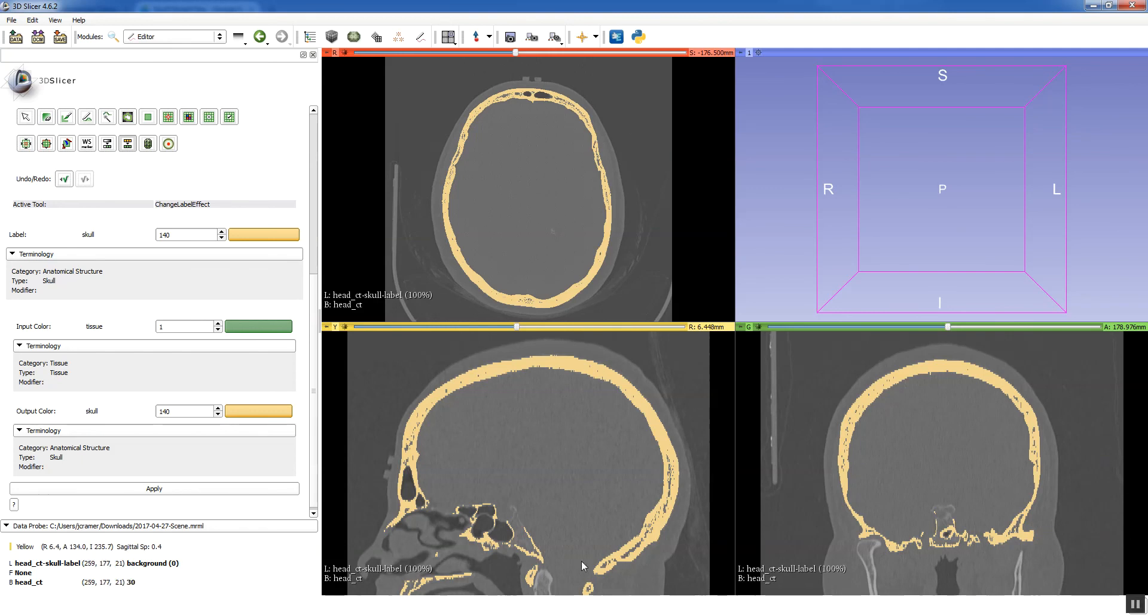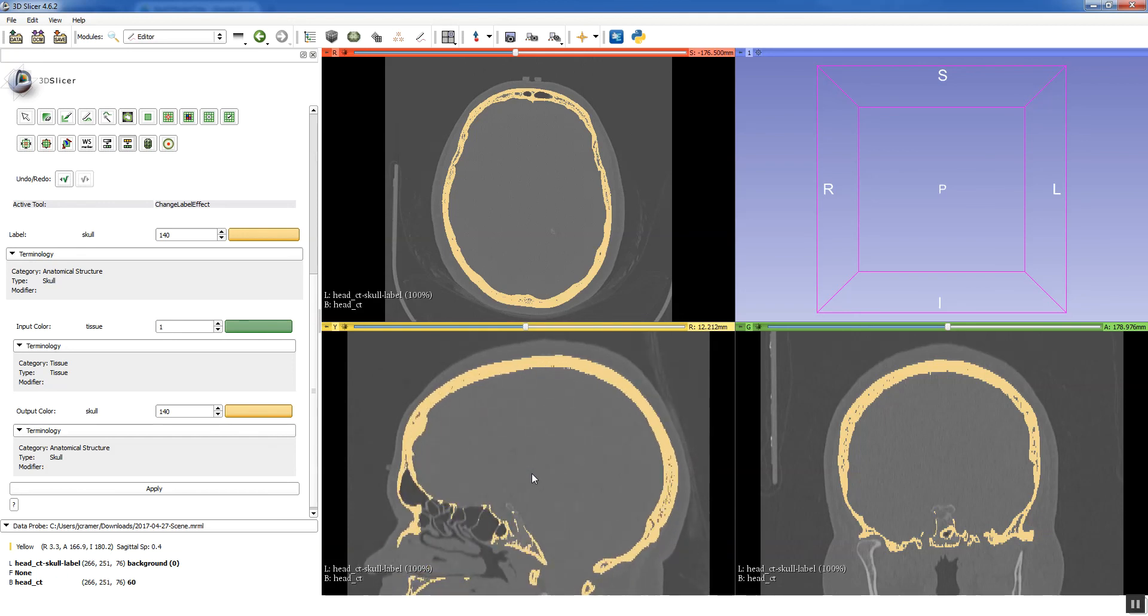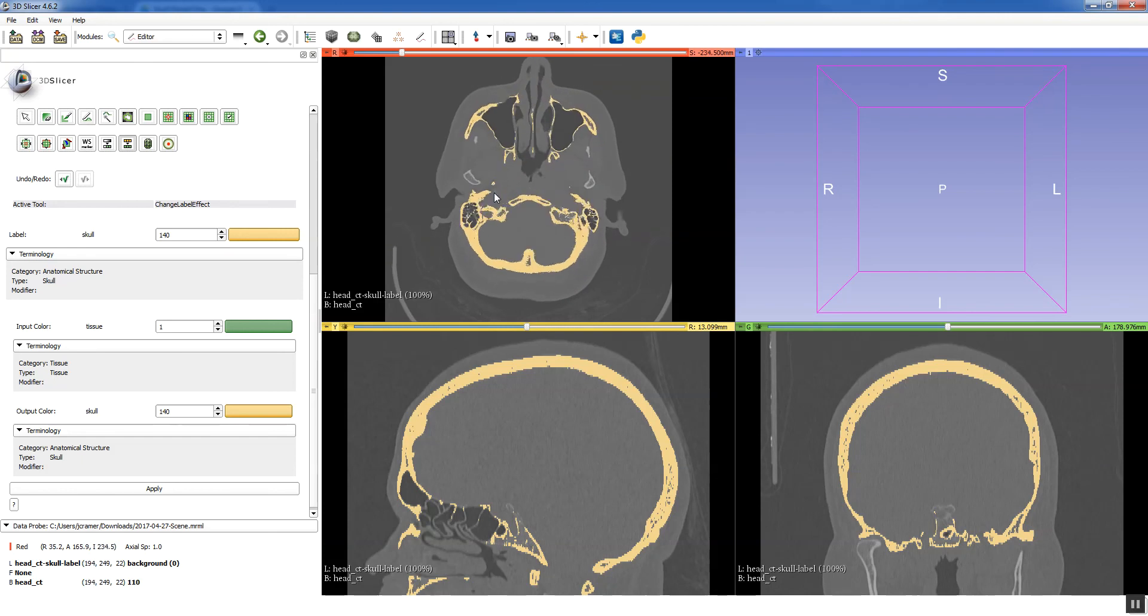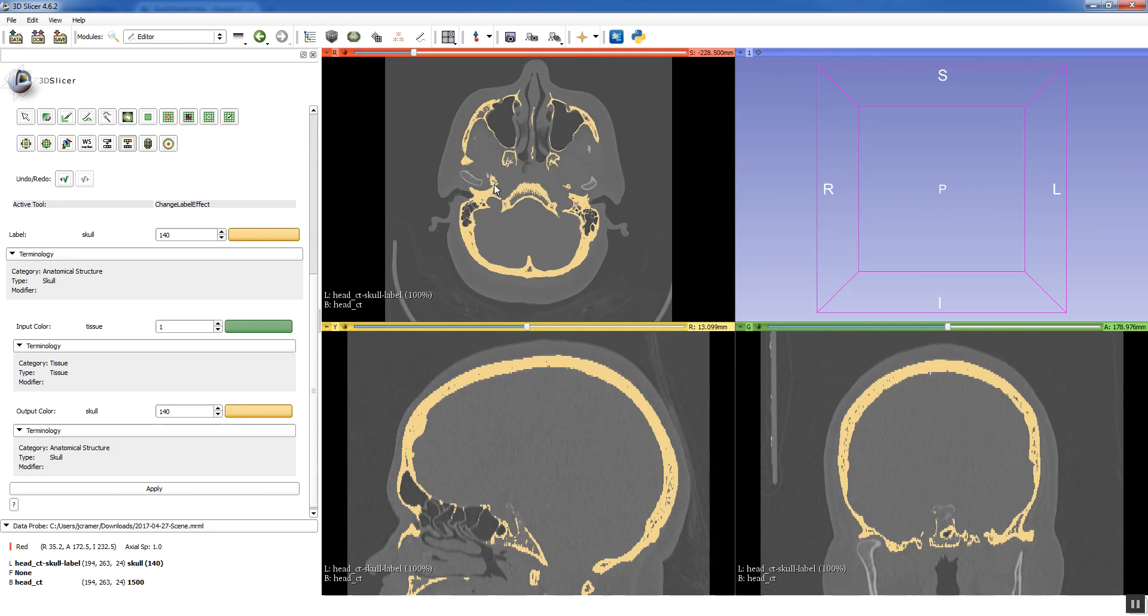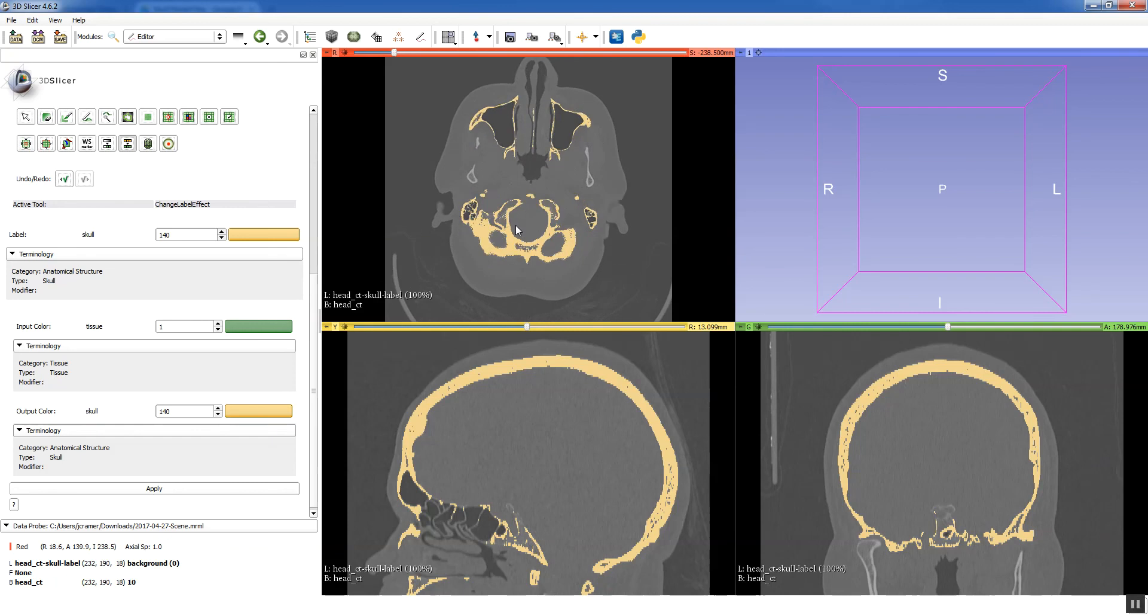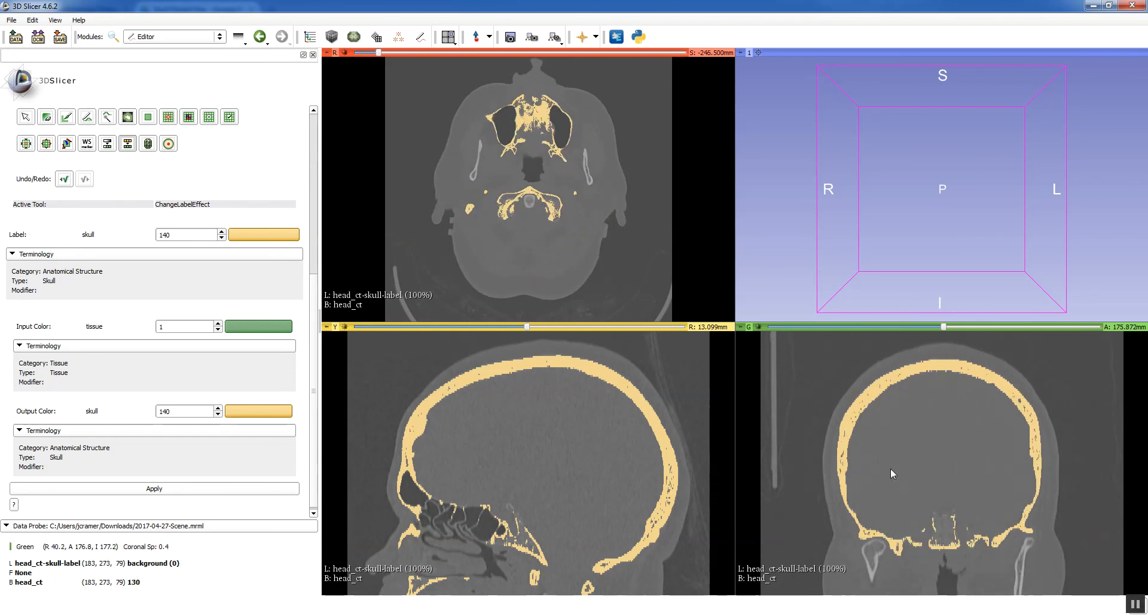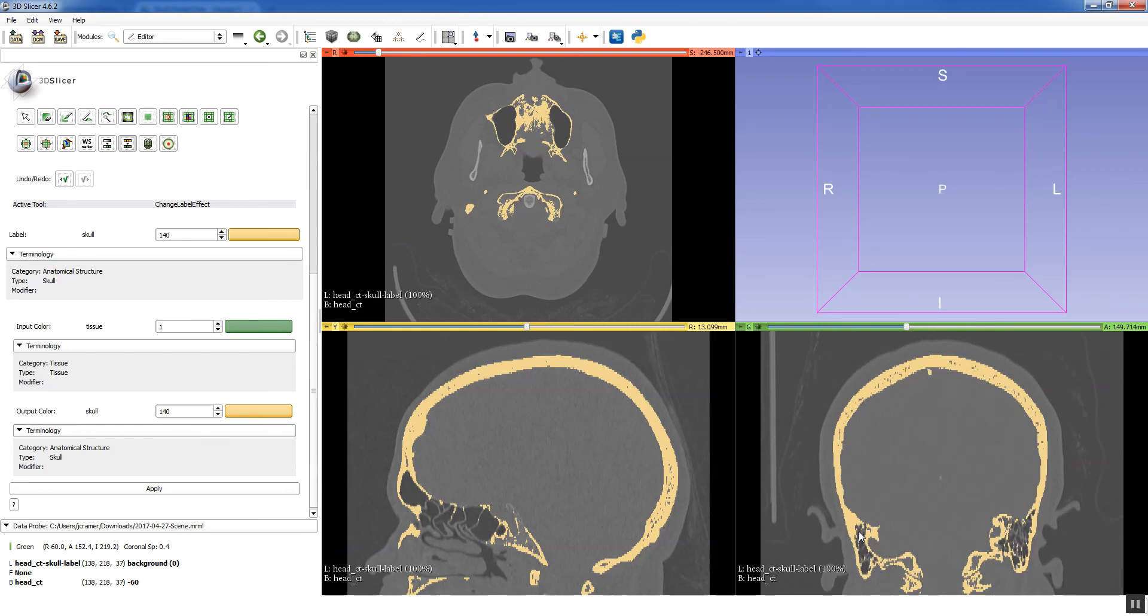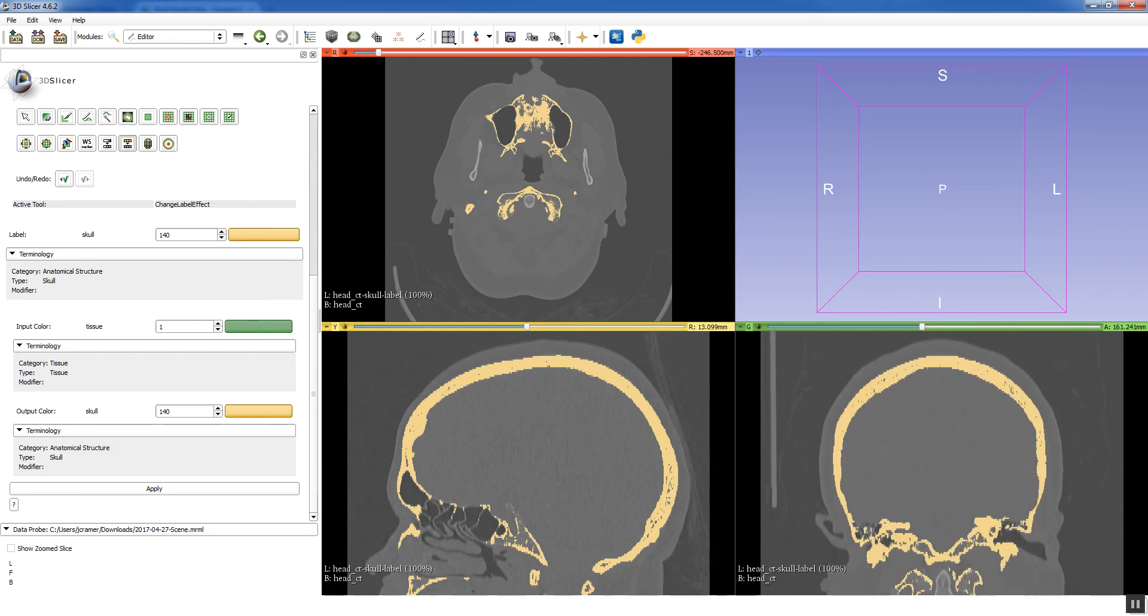The finished files on Google Drive will also have C1, C2, and the styloid processes removed. But will be pretty similar to this. So if you want to finish up disconnecting the styloid processes. And I don't want to make any assumptions here. It's the bony structure that comes out and comes down a little ways from the skull base on both sides. So I remove that. And then C1 is here. And that's best removed in the coronal plane. So disconnecting from the occipital condyles. So erase this part of it. Slice by slice. And then remove that.